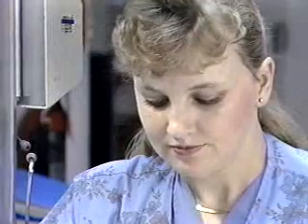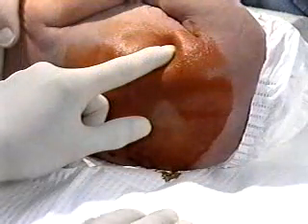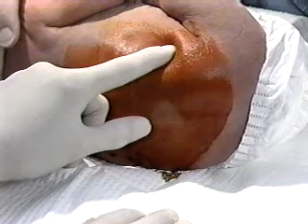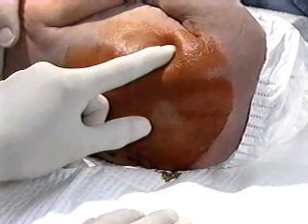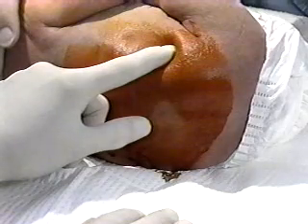Know the anatomic landmarks and don't deviate from them. The practitioner palpates or feels for anatomic landmarks with the non-dominant hand. The landmarks are the iliac crest and the spine. The index finger is placed over the iliac crest, and the thumb is placed on the spine.